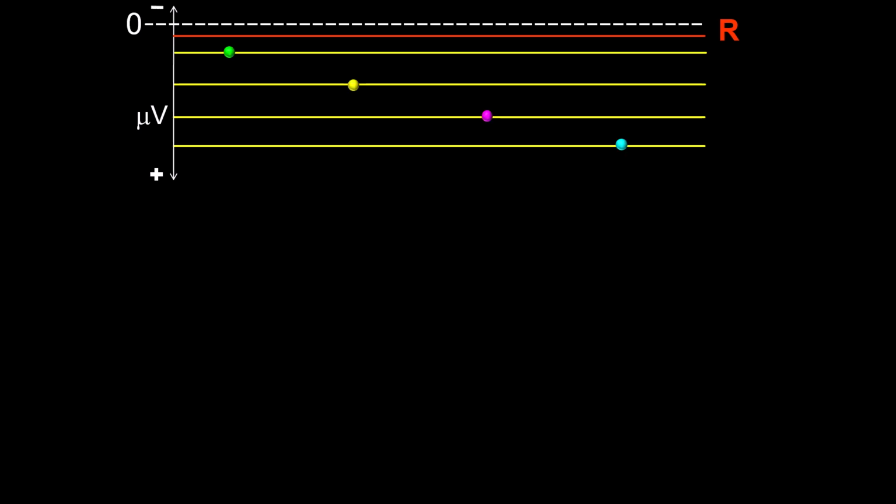In this new frame, I have represented four electrodes by adding four dots of different colors at different voltage lines. The green dot represents the most anterior position by virtue of its proximity to the vertical double-headed arrow line, and it is also the minimal positivity since it is the electrode that is closest to the neutral line or the zero line.